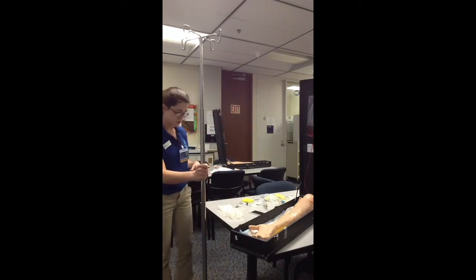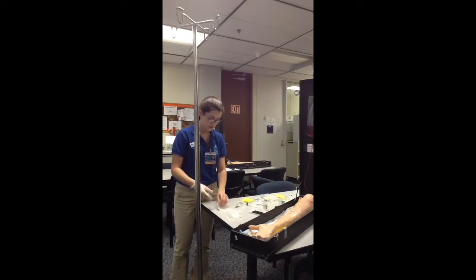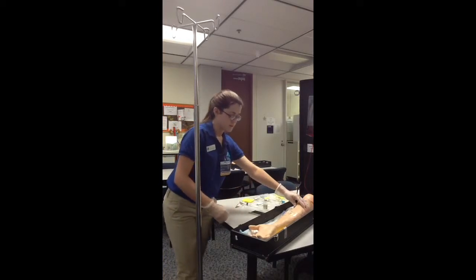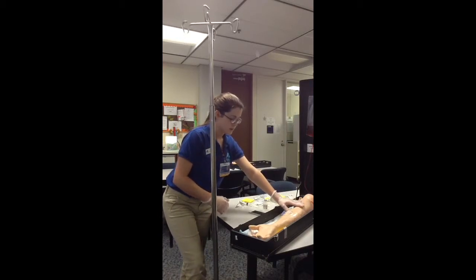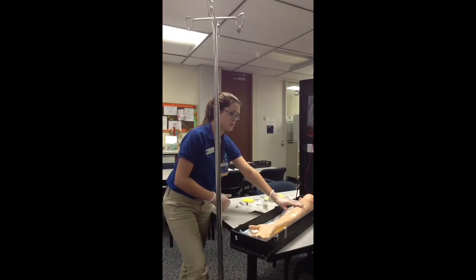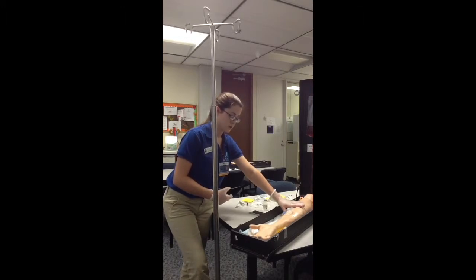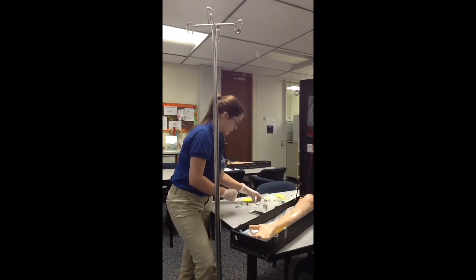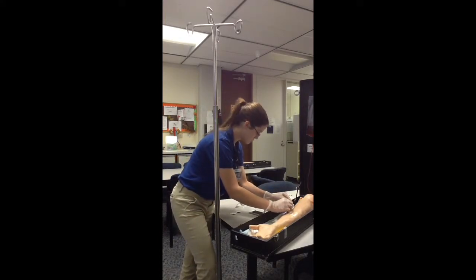Okay, and I'm just going to check your IV site. I'm going to wash my hands first and apply my clean gloves. Okay, and I'm just going to check the IV site for phlebitis or infiltration. I would know that it's phlebitis from heat, redness, swelling, or pain. And I would know infiltration from wetness, coldness, leakage, or paleness. Okay, so everything looks good. So I'm just going to clean the port really quickly with an alcohol pad.